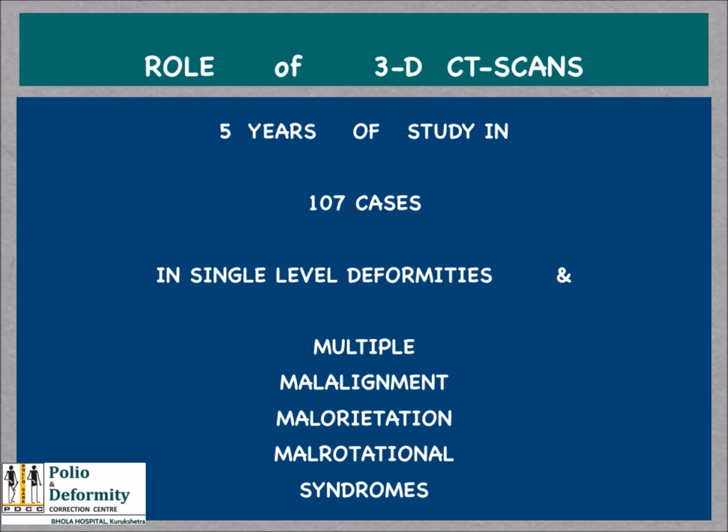To start with, I would like to tell that in the last 5 years, I have used this technique of 3D CT scan in 107 cases. The CT scans were used in single level deformities as well as multiple malalignment, malorientation, malrotational syndromes.